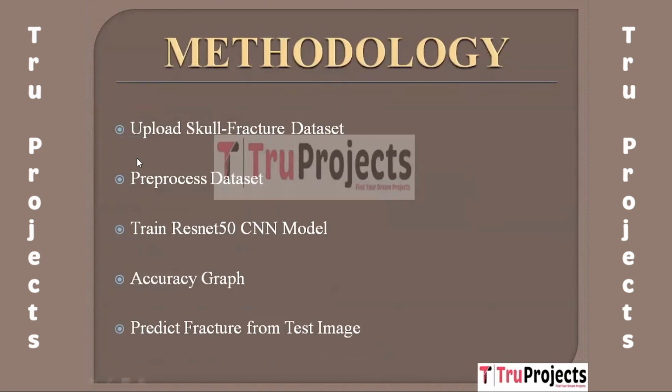The first module is Upload Skull Fracture Dataset. Using this module, we will upload skull fracture CT scan images to the application. The second module is Preprocess Dataset. Using this module, we will read all CT scan images and then resize them to equal size, normalize all pixel values, and then split the dataset into train and test, where the application uses 80% images for training and 20% for testing.